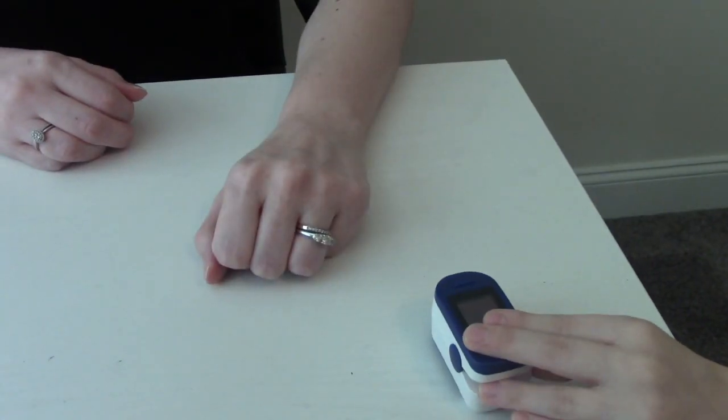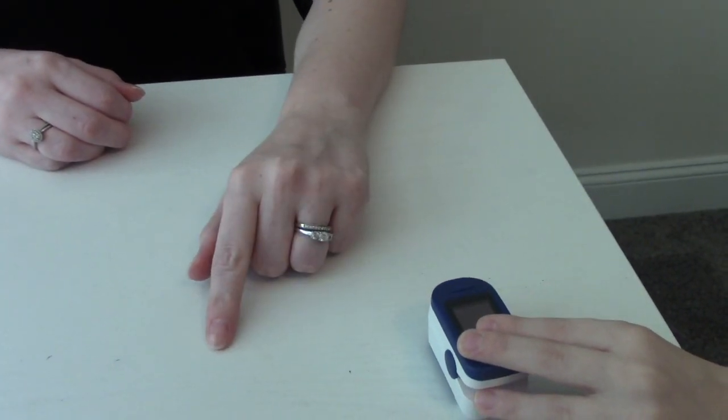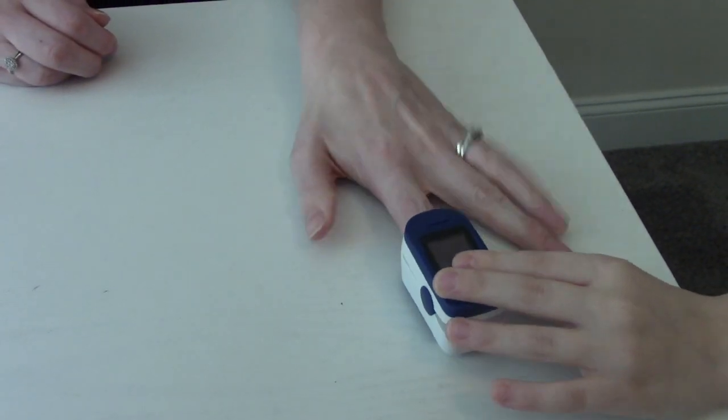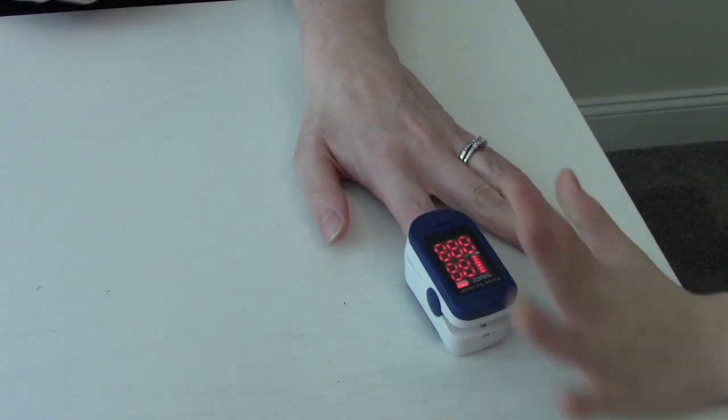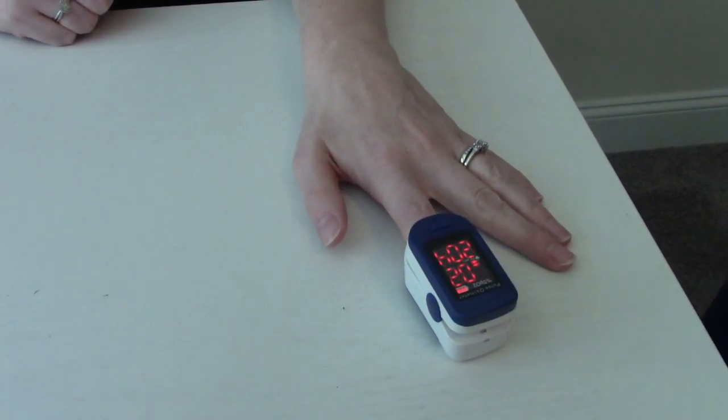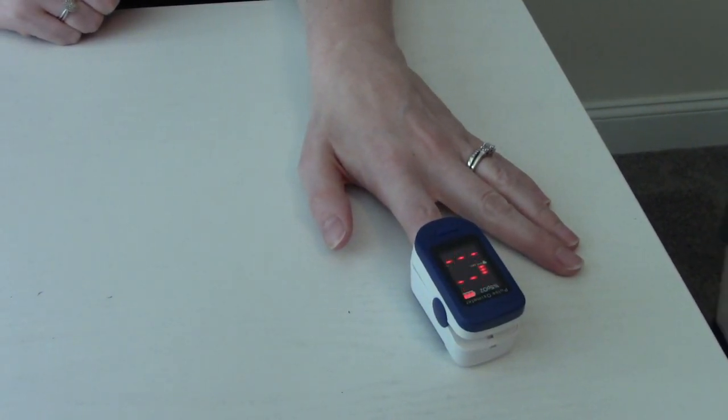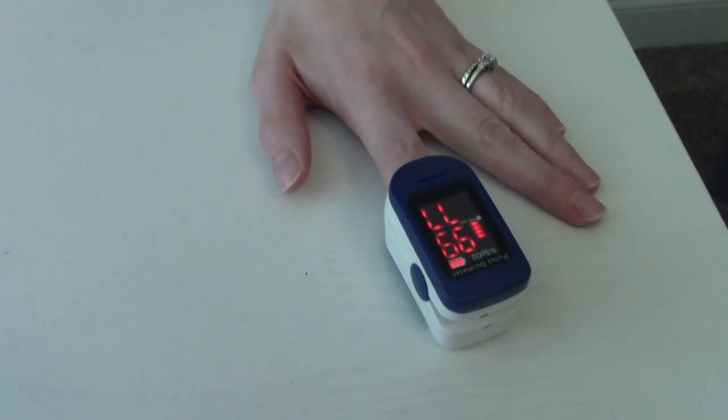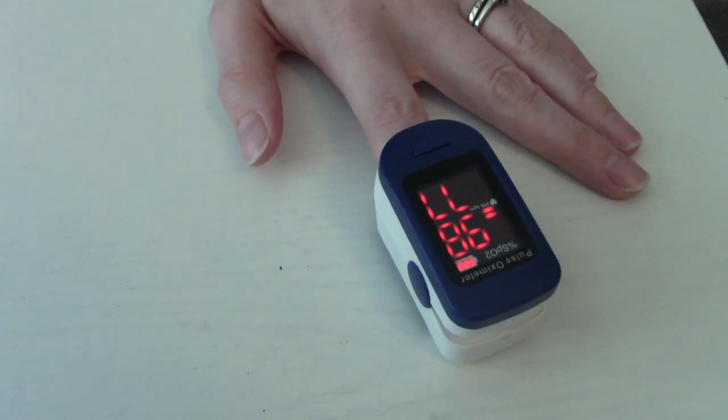To take a pulse ox, you'll need a little oximeter device like this. And it's very simple. You just place it on the finger, and then turn the button on. And this will tell us our O2, and it will also tell us our pulse. So for mine, 99% on room air, and then my pulse is 77 beats per minute. So that was my video on how to take vital signs.